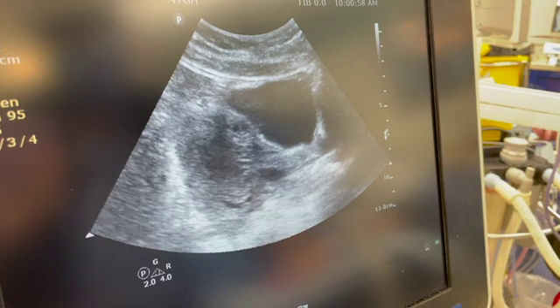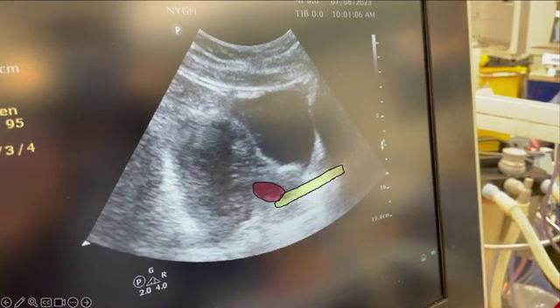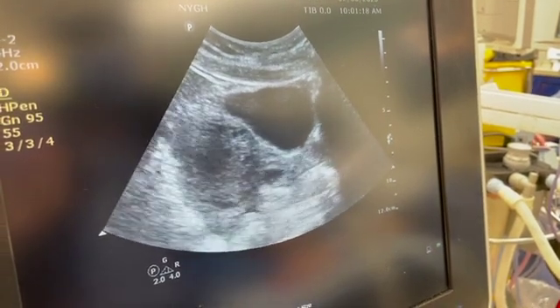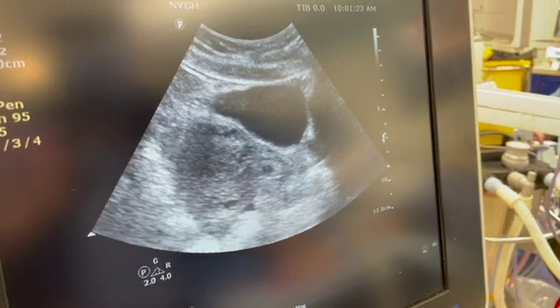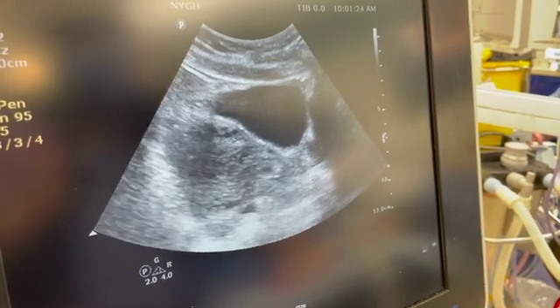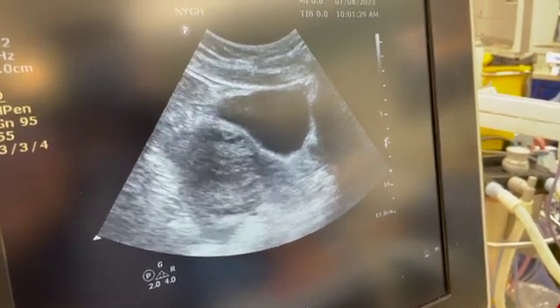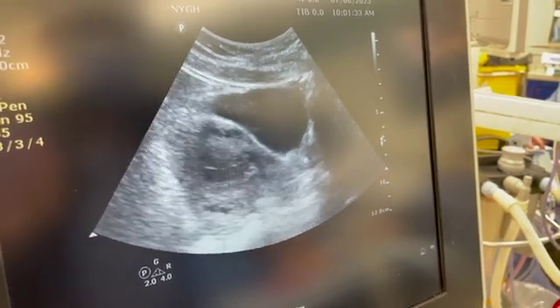Without need for dilation, a 9mm suction curette was then inserted into the cervix under ultrasound guidance until the opening of the curette was at the level of the gestational sac. In general, a larger width curette will allow more content to pass through more easily and quickly and is less likely to perforate. This video shows the disappearance of the cervical ectopic on ultrasound as suction curettage is performed.